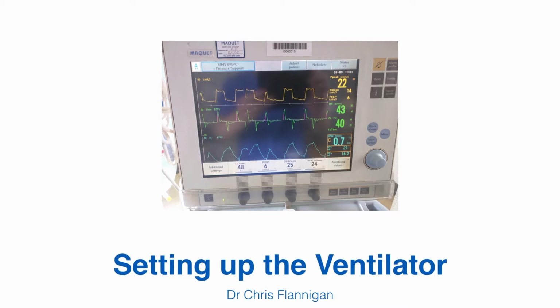Okay, so you've told the ventilator what gas you want to use and how often to blow a breath into the patient. But the ventilator also needs to know how long it should deliver that breath over, and that's called the inspiratory time. And again, that varies with age. We've said the respiratory rate goes down with age. So if it goes down, the amount of time you've got for a breath increases.